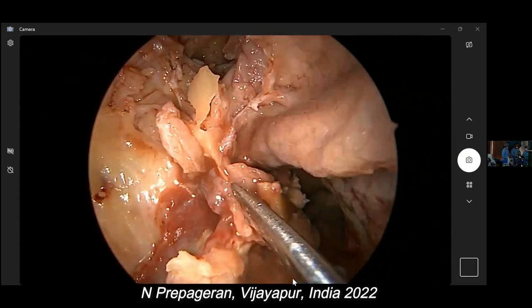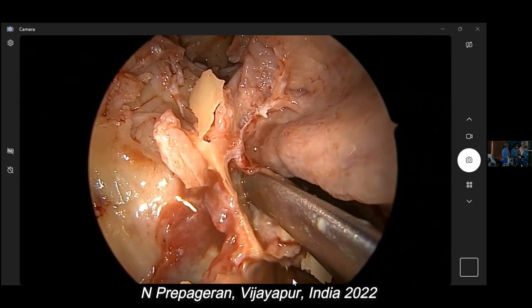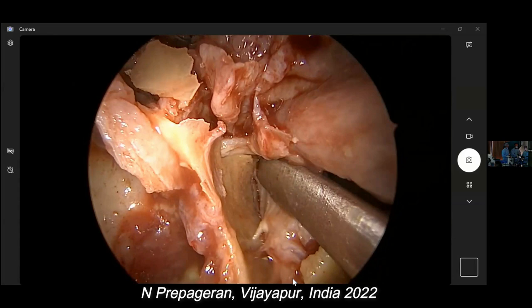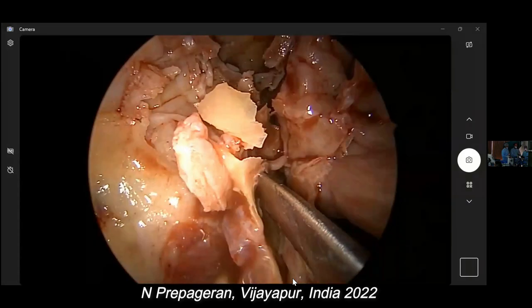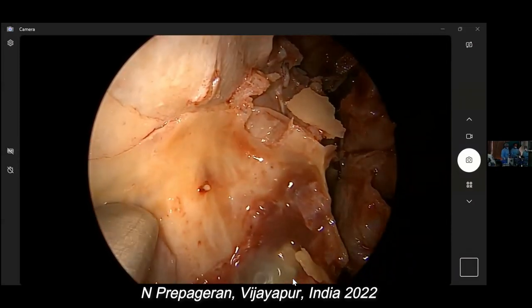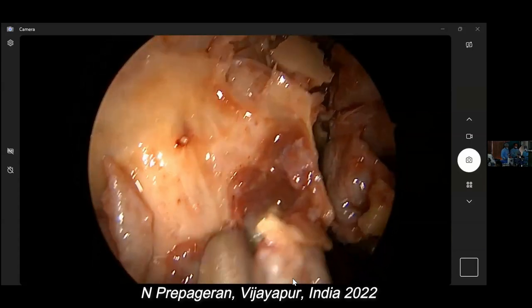Go subperiosteal. Very important. If you go subperiosteal and you dissect, there's nothing there but the artery. There. That's SPA. Do you guys see that? So that's SPA. So now that we have done that, you can see the maxillary artery, infraorbital nerve. Maxillary artery here.